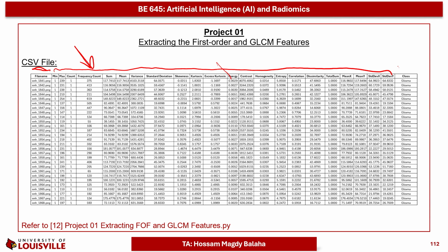And also you will find the category of the different classes, starting with glioma, and if you scroll down, you'll find other classes. So simply, you can pick this image and compare the excess kurtosis and also the skewness for a single category, or you can pick an image from this category and another from another category and compare and interpret both of them.